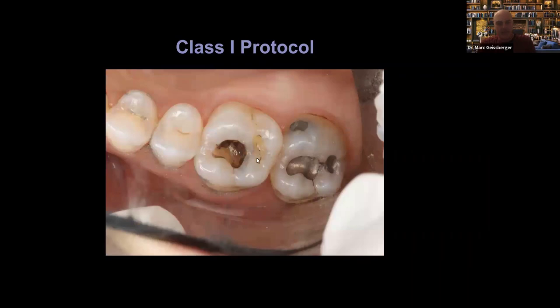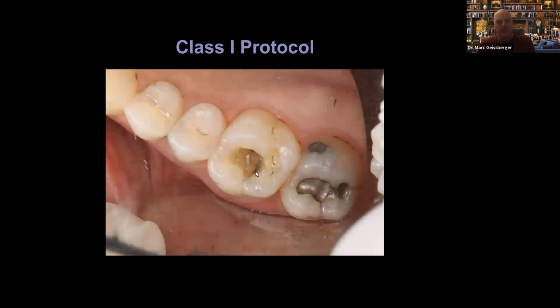So unfortunately, this is all going away. The other thing I always do is remove any little surface stain at the cavo surface, so that I have a clean area to work from. Now, this is it cleaned up with a decay out. I'll come back in here and remove this stain, and I'll put a nice little bevel around the enamel. Why do we bevel enamel? It really helps hide my restoration, increases surface area, decreases micro leakage around the cavo surface.